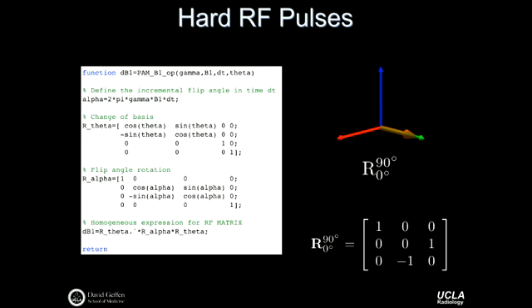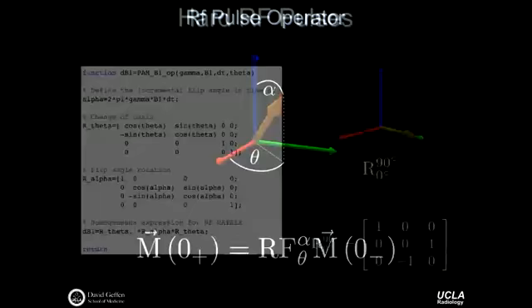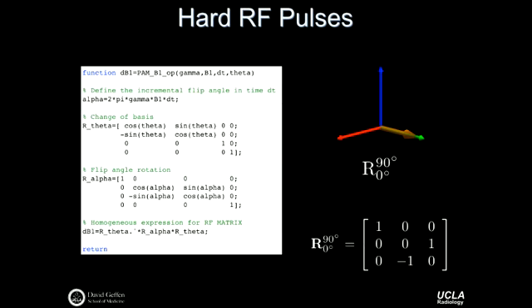Now I'm trying to lay the groundwork for the mathematical description of what's known to happen, and do it through a matrix description. So if we go back to this one, in this example we said this is an RF pulse whose phase is 0 degrees.